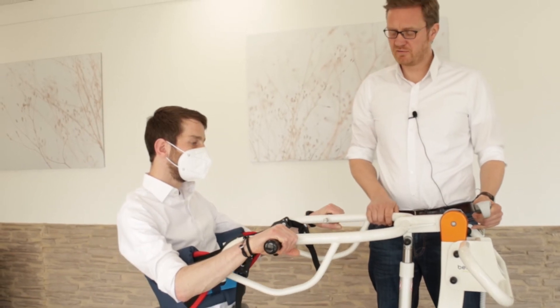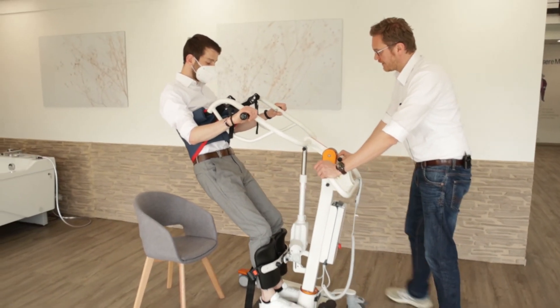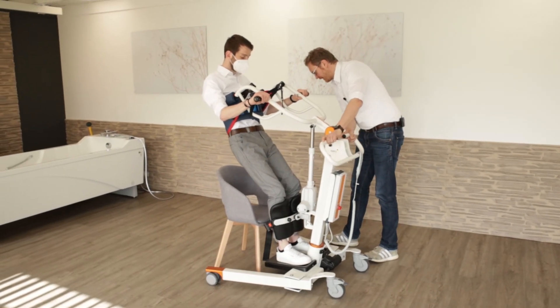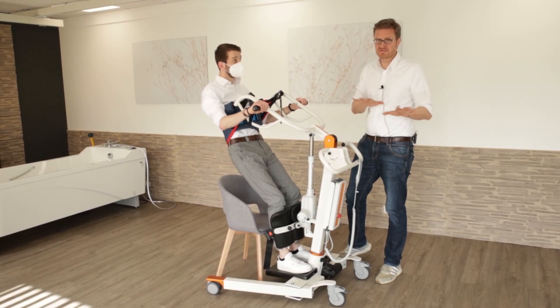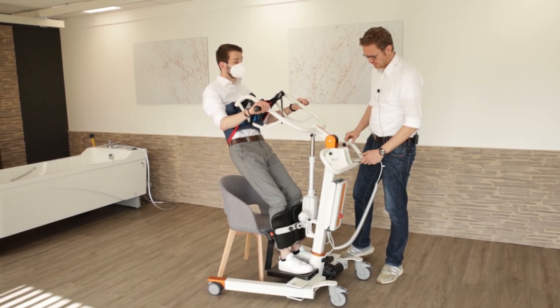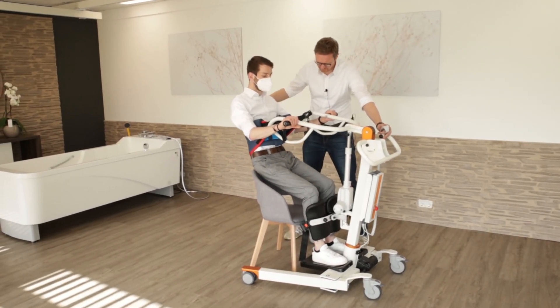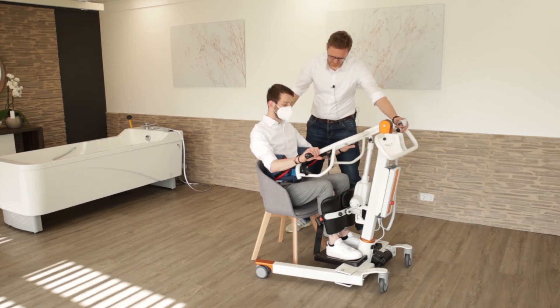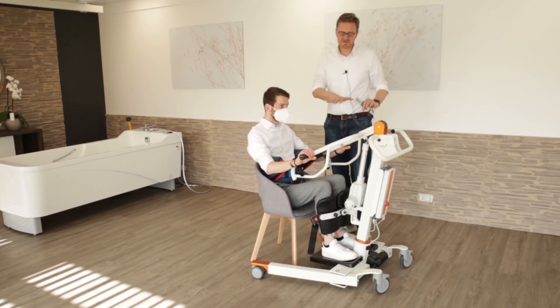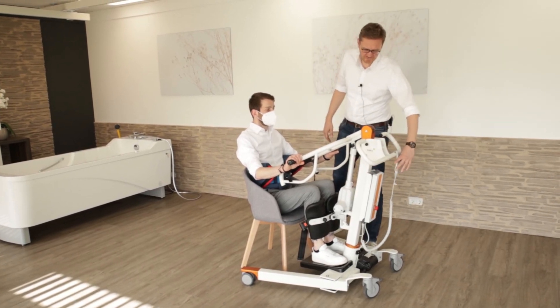And we lift our patient up. Now we bring him back to the chair and we are positioning him very closely with his legs at the edge of the chair. We don't use the brakes now, so the lift will be positioning itself. And now we're going to lower him down. We are close to the patient, taking care that he's secure. And you see the lift will move and he will be safe at the edge of the chair with his back.